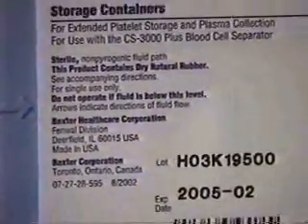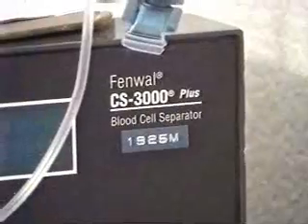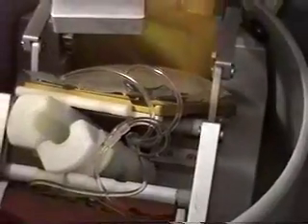This is called a Baxter Fenwall closed system apheresis kit. And it has the blood bag that stays with it, right? So you put the blood bag in the centrifuge — that's how you keep everything isolated. Okay, with PL 301.